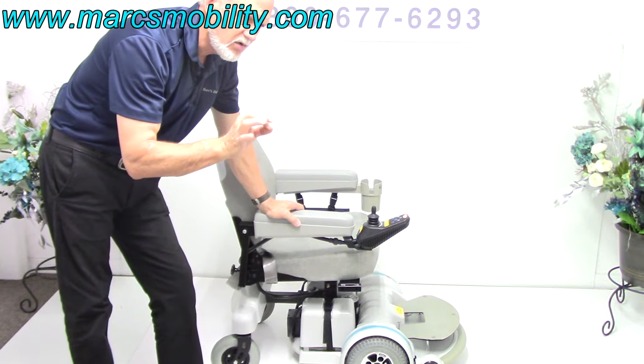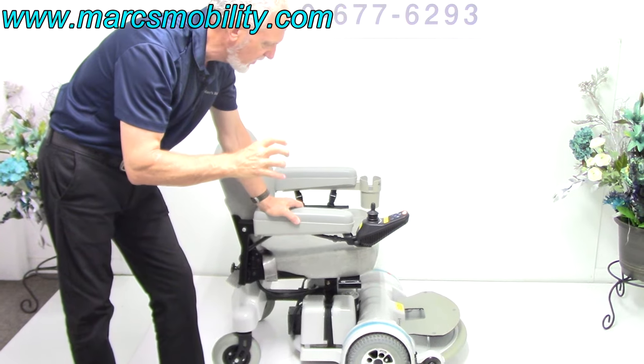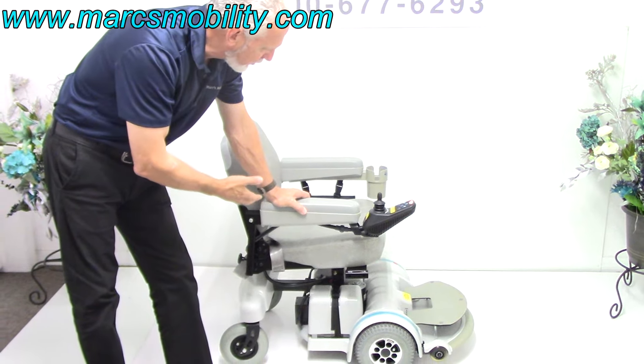These motors are a little bit noisier than most motors because they're high-geared. They're heavy, heavy-duty motors. As you can see, this chair is in brand new condition.